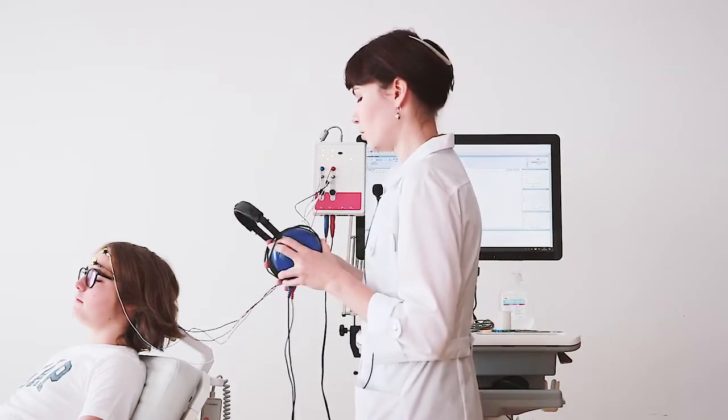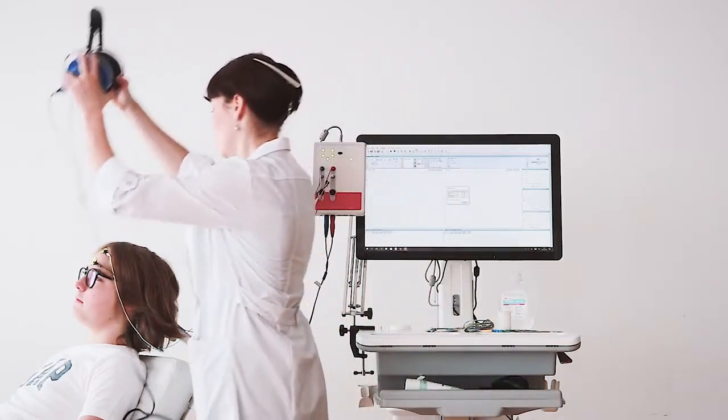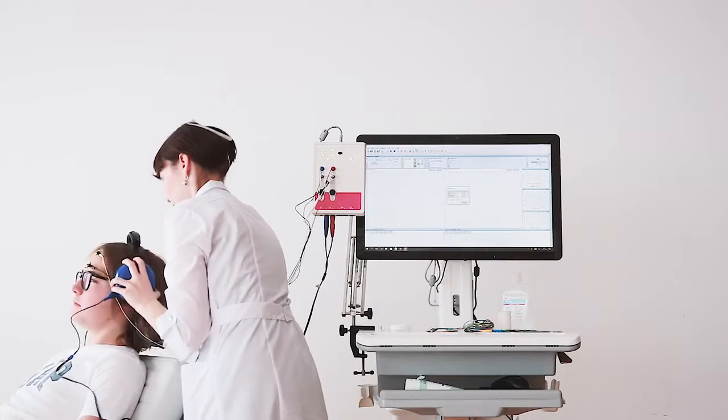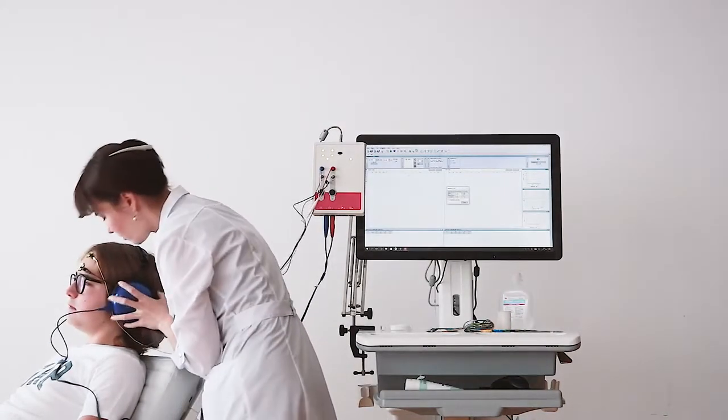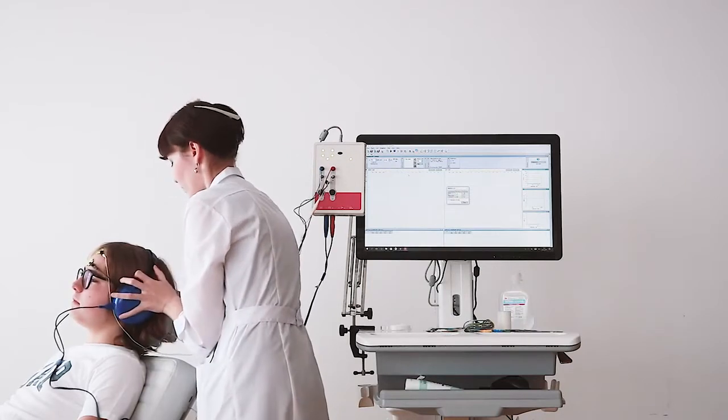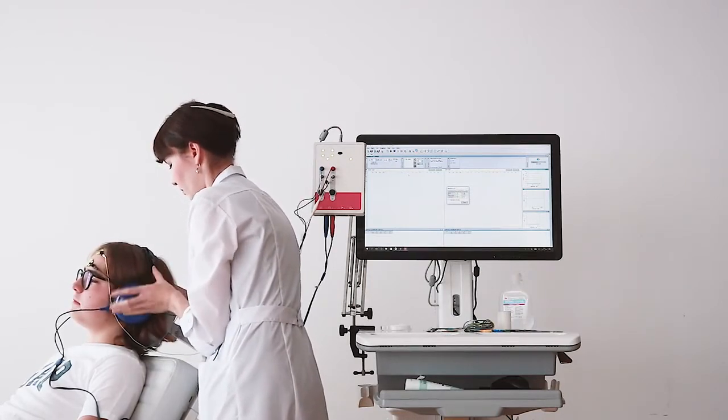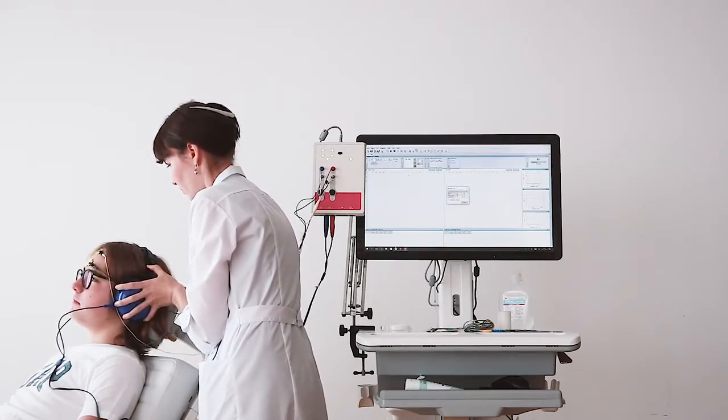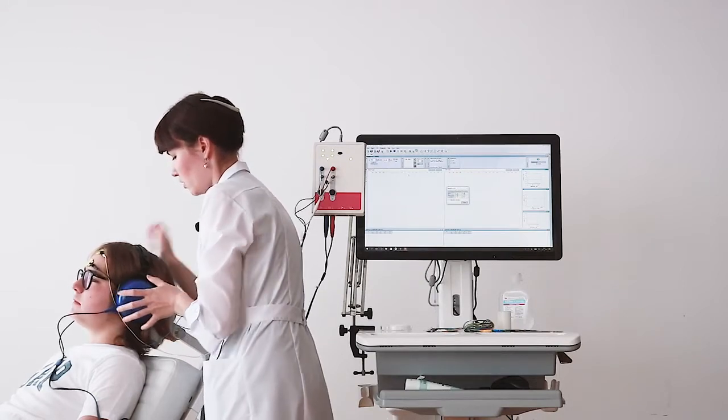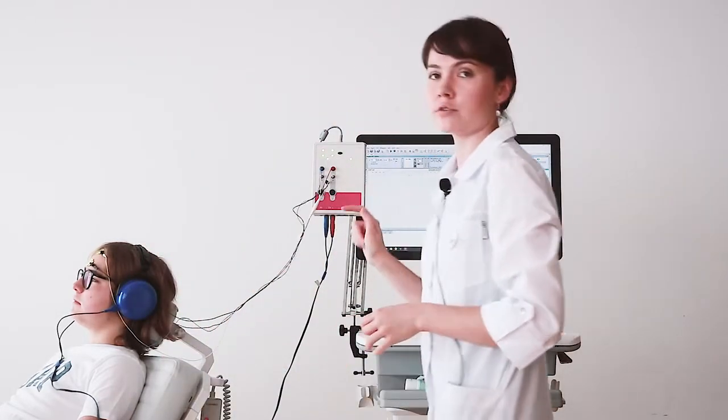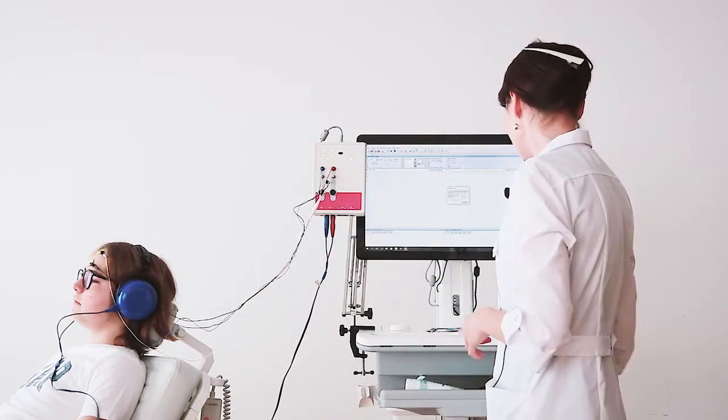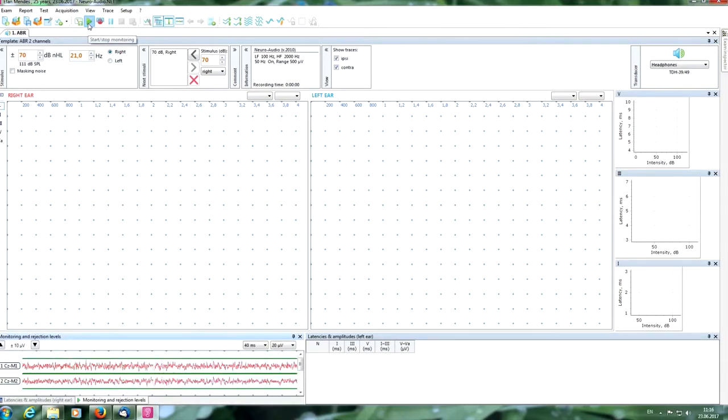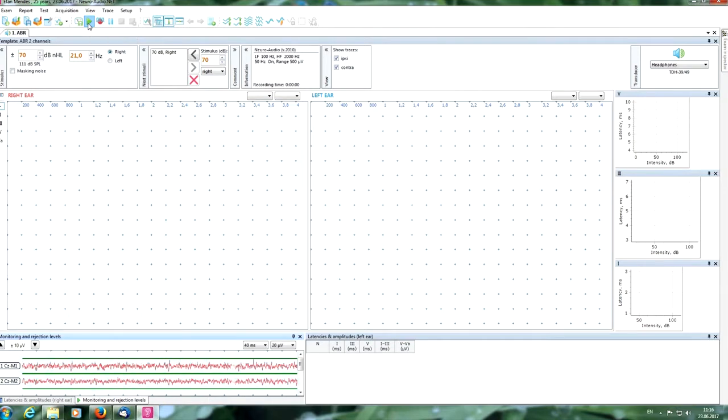Now we can put it on the head. You can regulate the size to the size of the head of your patient. Now check the signal quality, pressing the monitoring button. It is good in the green borders, as you can see.